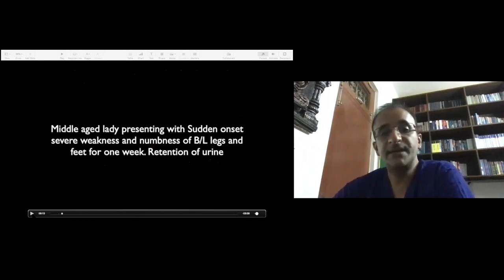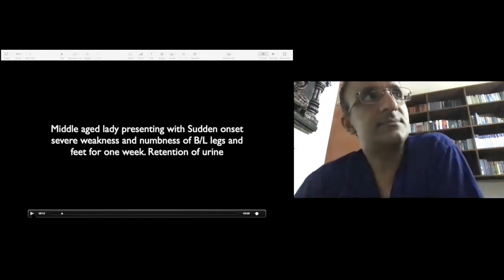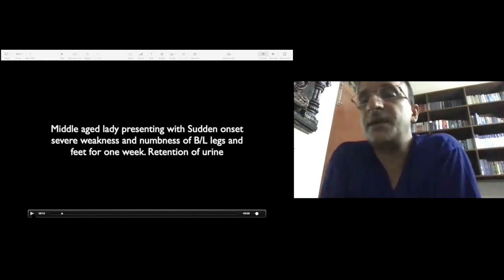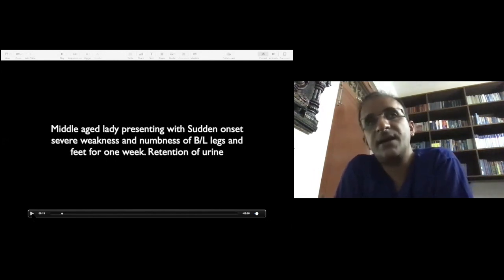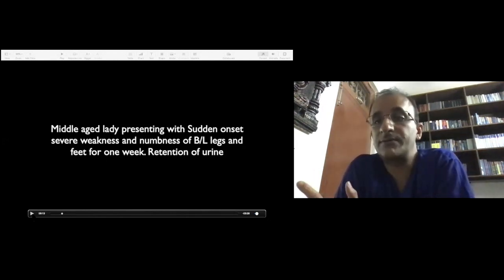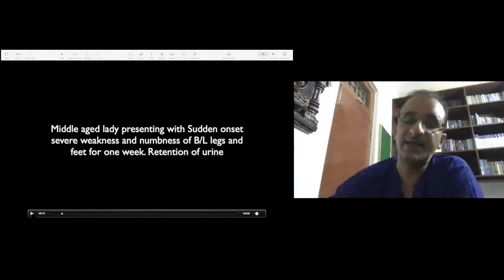She is a middle-aged lady who presented to me with sudden onset cauda equina: severe weakness in both legs and feet, and retention of urine. The neurosurgeon who was with me didn't want us to go transforaminal. He said that she has cauda equina and not just radicular symptoms. But I was pretty sure that we could achieve a good result with transforaminal because the indications were right.